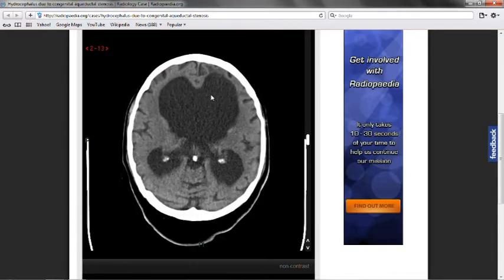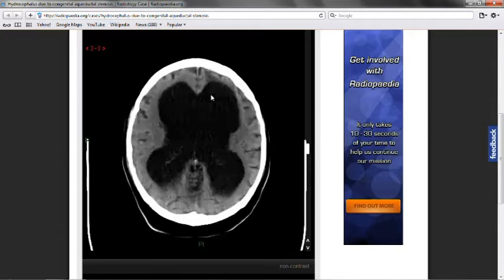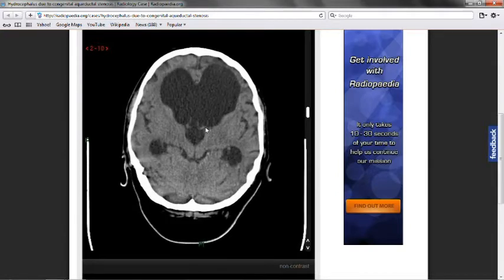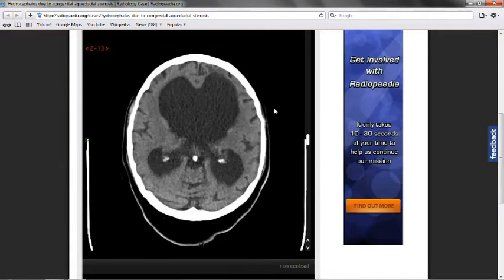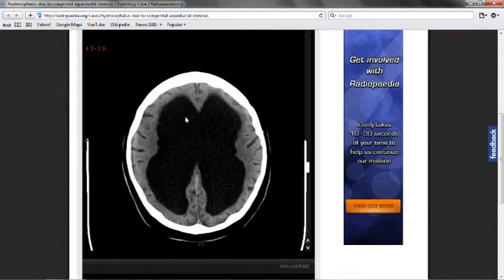And so we're seeing widening of the lateral ventricles here as well, with also widening of the third ventricle here. But we would also expect the patient, based on 55 years of age, to have slightly abnormal ventricles anyway, to be slightly enlarged. And so the difference between the enlargement and the hydrocephalus can be questionable, but we do see that there are a lot of widening portions here.